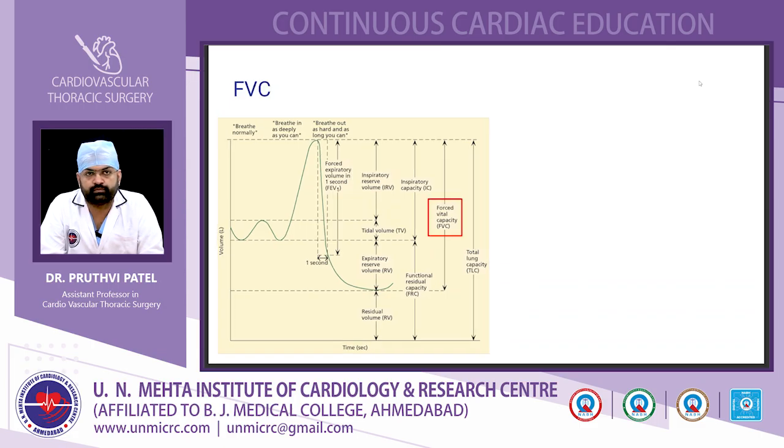This is forced vital capacity. It includes the inspiratory reserve volume plus tidal volume plus expiratory reserve volume. So to measure this, we have to breathe normally, breathe in as deeply as you can, then breathe out as hard and as long as you can.